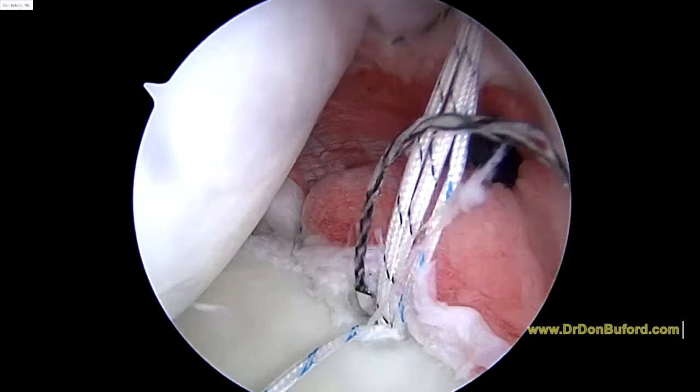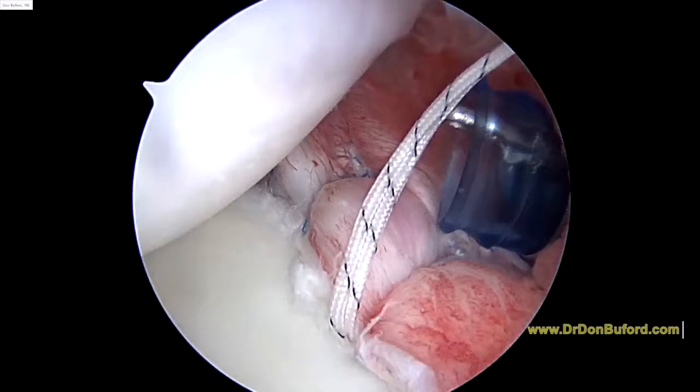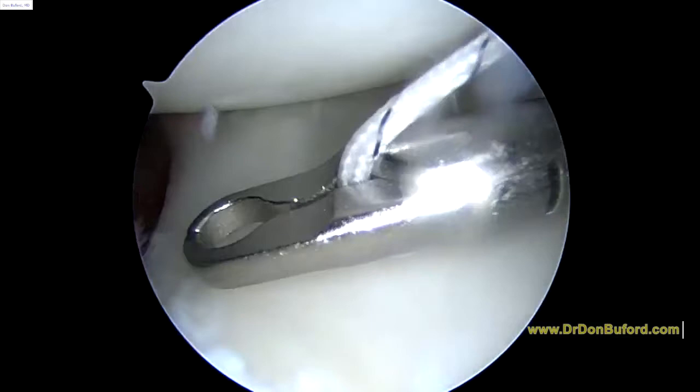Here's our next stitch. You'll notice that this anchor is double loaded because we may have to use two stitches here. So we've got three sutures tied — it looks a lot better. We've still got one more suture we can try and utilize here. We're going to pass this out to the front again.